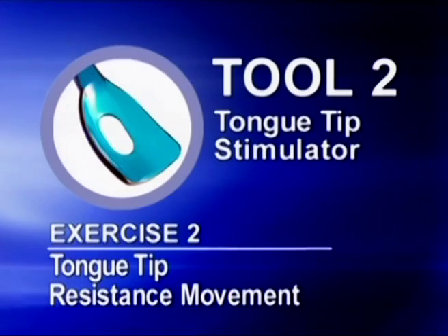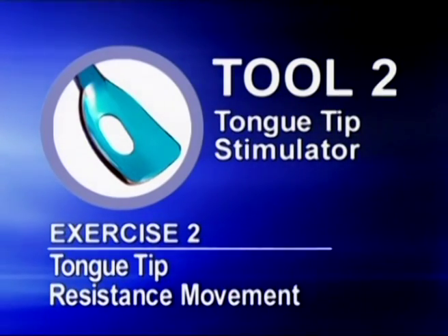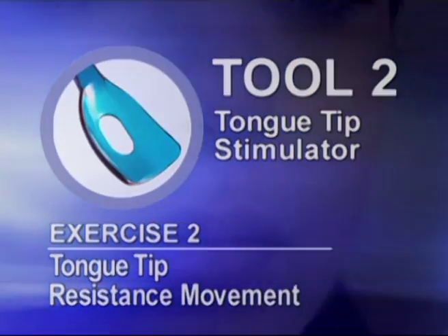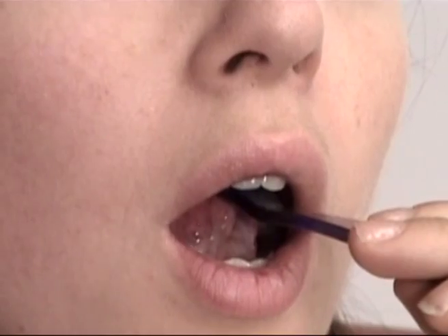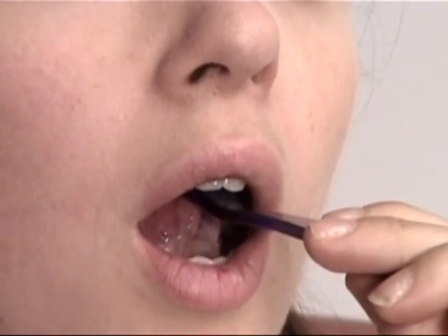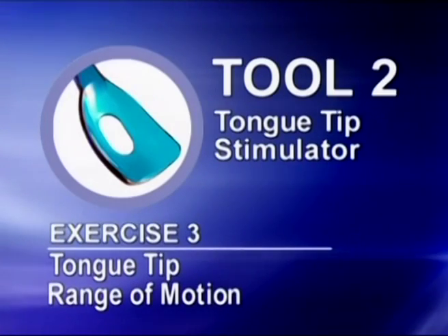The goal of exercise protocol 2 is tongue tip elevation strengthening. Place tool number 2 on the palate behind the front teeth. Press the tip of the tongue into the hole opening. Apply pressure as long as possible. Record number of seconds that pressure can be maintained.